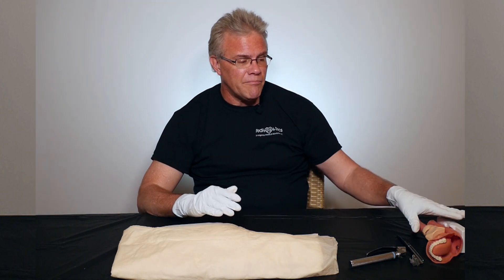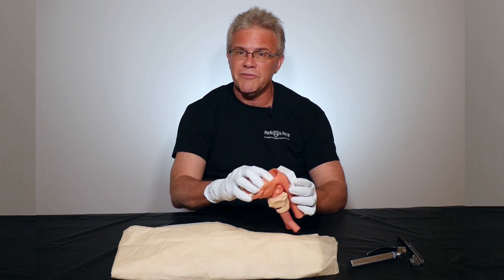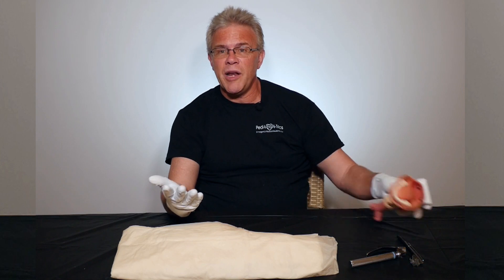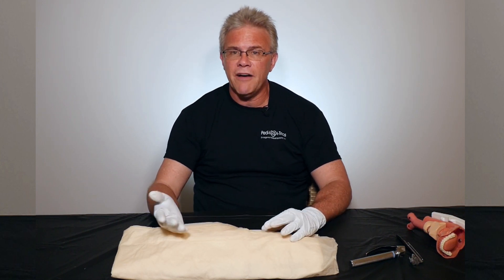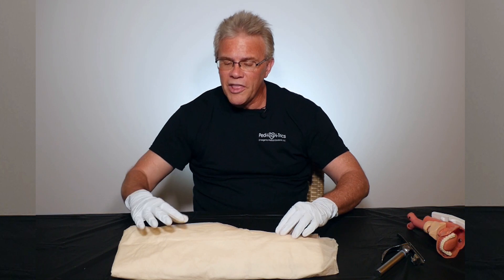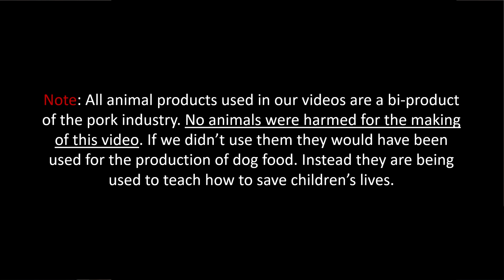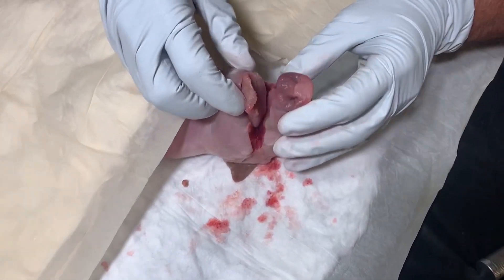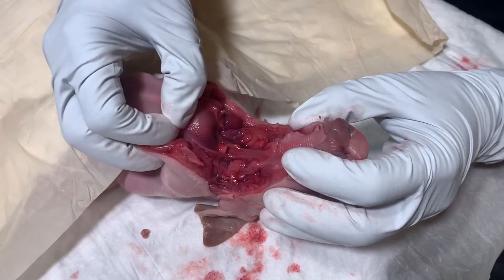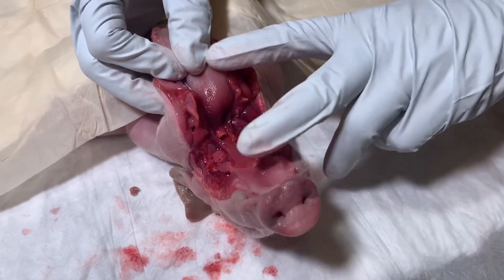That's what most people experienced in school — you saw the nice mannequin with the tongue, the beautiful epiglottis, the vallecula, and the cords, and that's how many people learned to intubate. However, in our courses we believe that if you really want to learn, you have to touch tissue. So here we've taken one of our fetal pigs and cut away the airway to show you what you're actually looking for and how a curved versus a straight blade actually works.